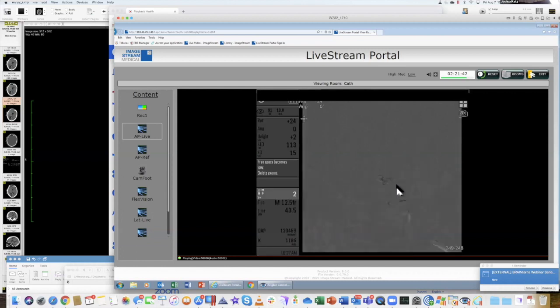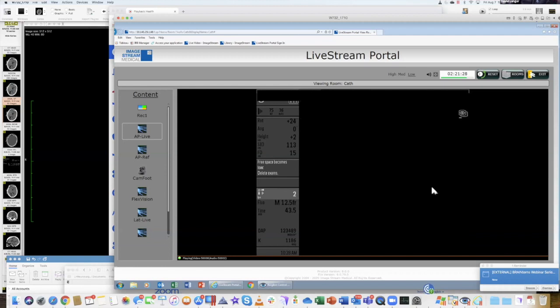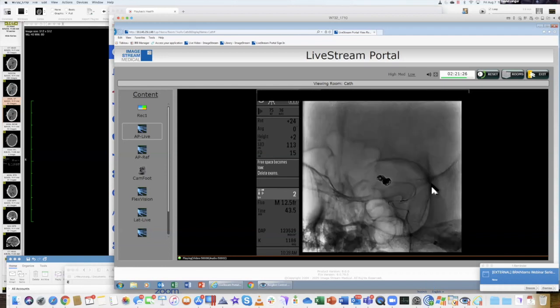People are wondering if you ever have issues with the computer during it, and what would happen if the computer went down. Yeah, we've had that problem. It's all software, so sometimes we have to restart the machine. It's very dangerous. When that happens, you just stop everything and don't do anything. I mean, there's a huge computer that runs this thing.